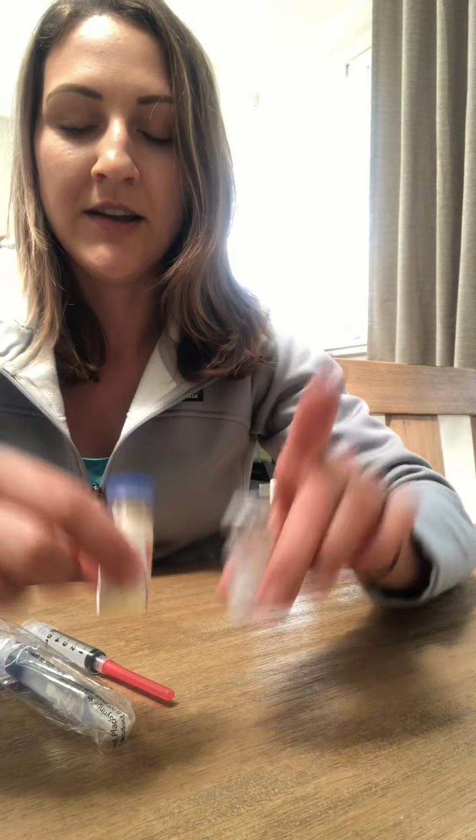I'm gonna assess for pain, and I'm gonna do my second check of medication administration by scanning the patient's wristband. I'm also gonna be asking them if they have any allergies at this time and comparing that information with what's in the MAR. And then I'm gonna be scanning the medication. Again, maintaining the 5 rights of medication administration.